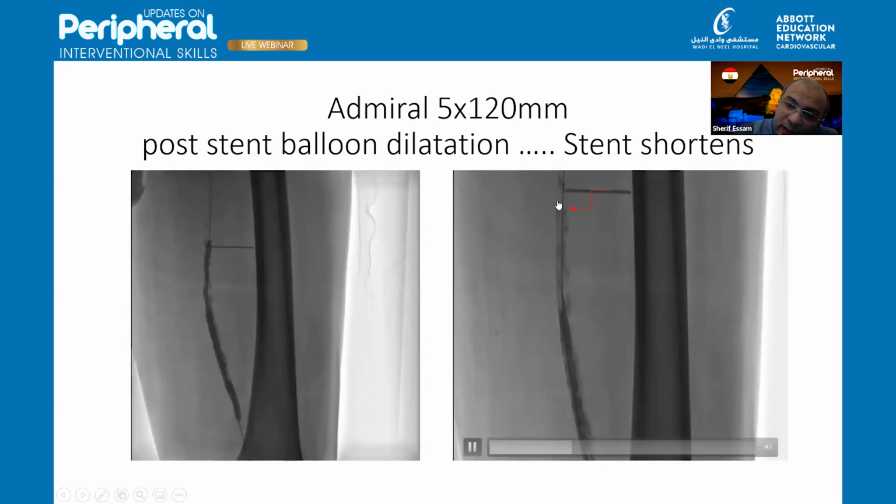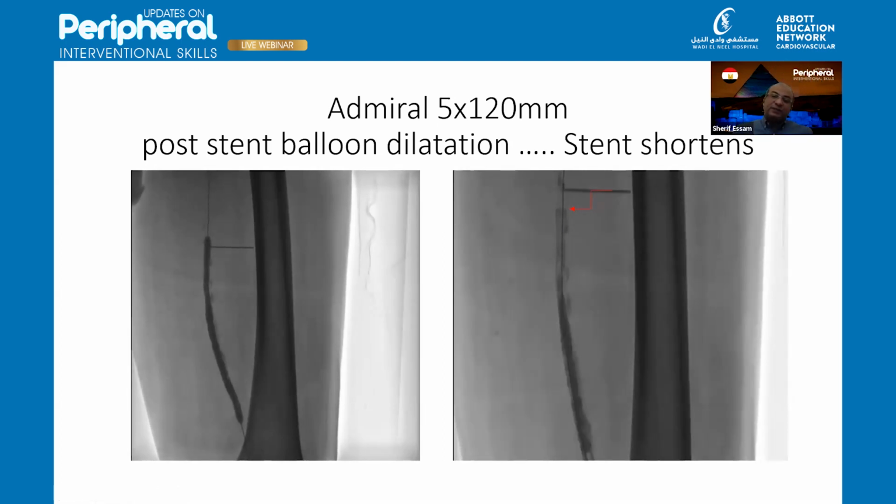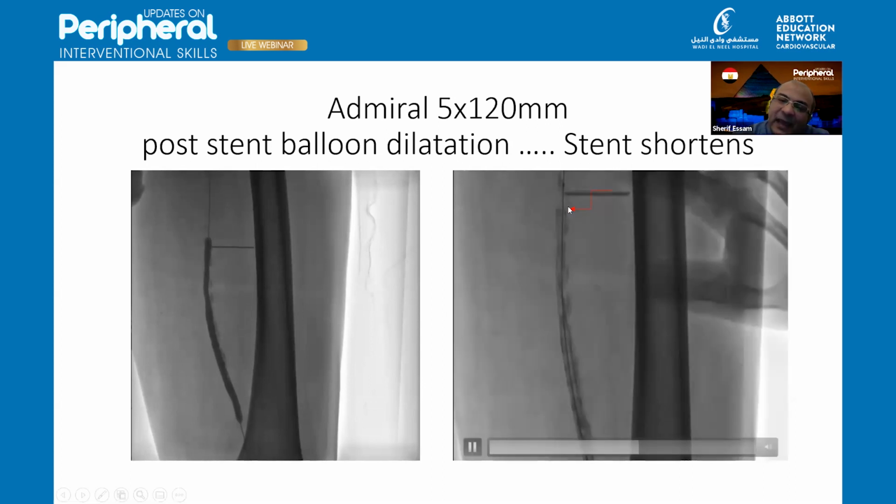And after the balloon, it opened nicely, but it came to here, which is intuitive and logical, because this stent is not struts fixed together. It behaves as one unit. So this is one point to take care of. I don't want anybody to make this mistake again.